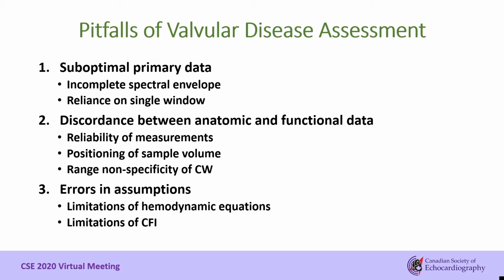The common pitfalls in the assessment of valvular disease are summarized in my last slide. We need to be particularly obsessive when reviewing suboptimal studies. Do not accept measurements based on incomplete velocity envelopes. Multiple windows need to be used, particularly in the setting of eccentric flow jets.